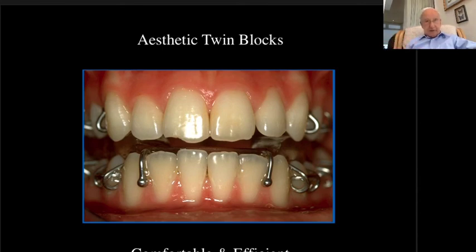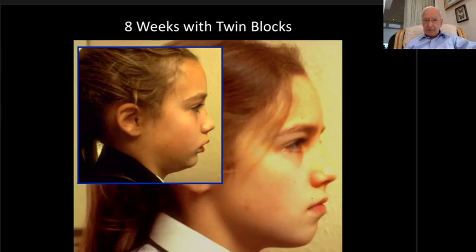If you want to go further than that, you can add a little cement, a temporary cement, so that the patient absolutely cannot remove the appliances during the first few days. They adapt to eating, speaking, wearing them full time, and that can improve your cooperation with removable appliances by 80%. I have had that feedback from patients abroad who use that system.